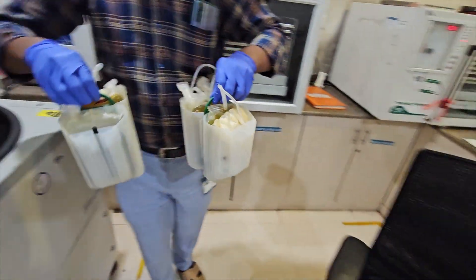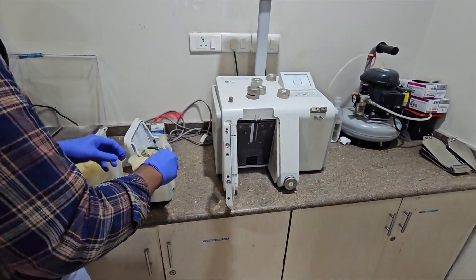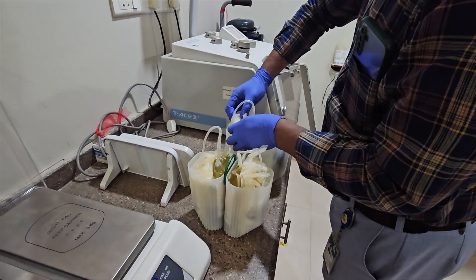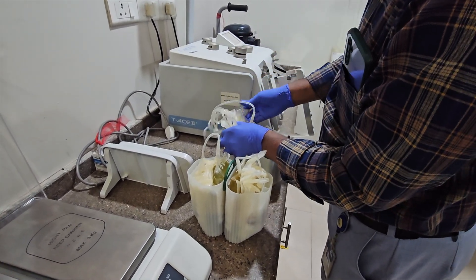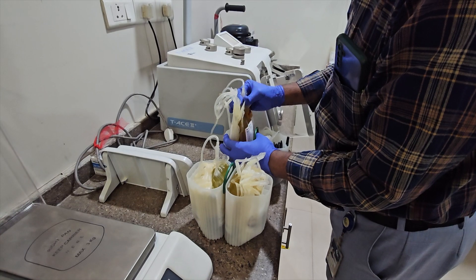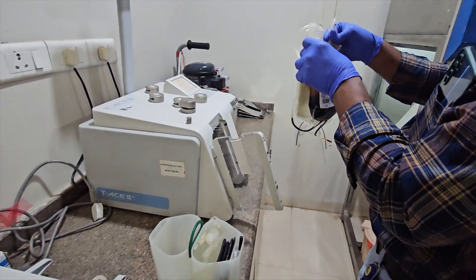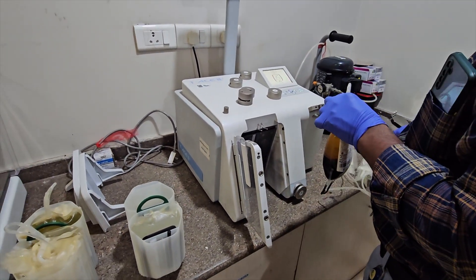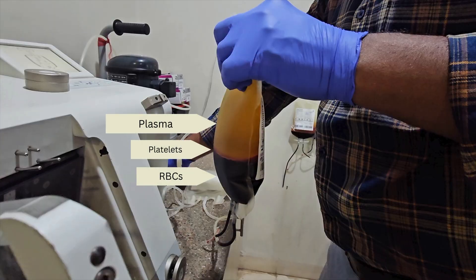The buckets are removed carefully without disturbing the sediments. The heavier RBCs settle at the bottom, with a platelet rim at the center and plasma at the top.